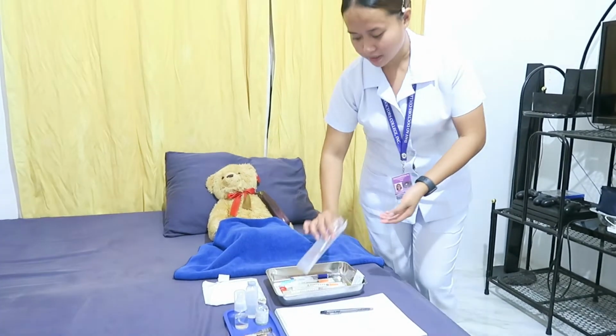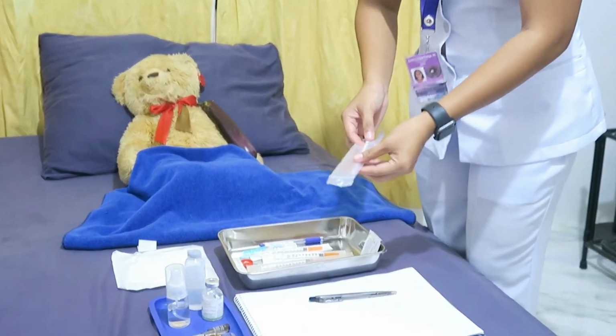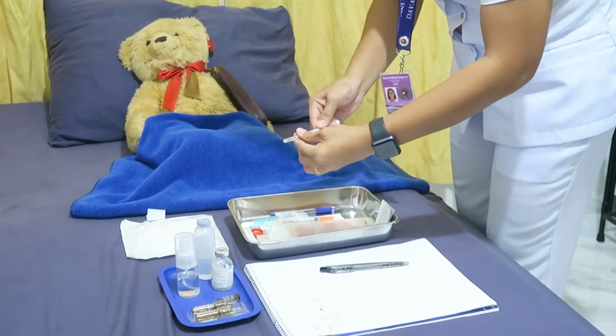Attach a filter needle as agency practice dictates to draw up premixed liquid medication from a multi-dose vial. This is the syringe that we need to use, and ensure that the needle is firmly attached to the syringe. So, I need to change it into the other.